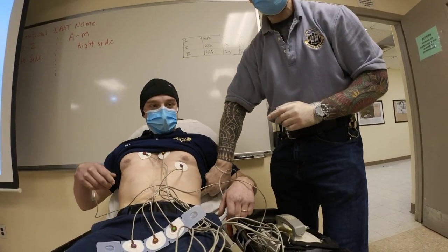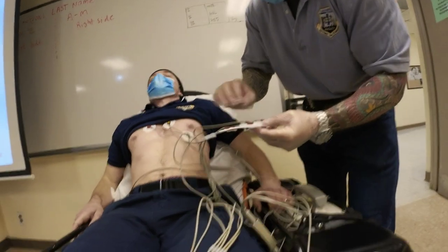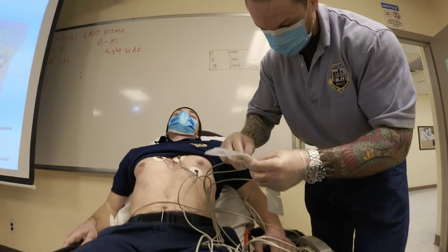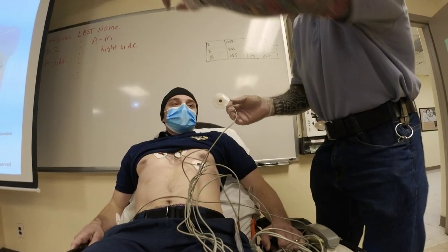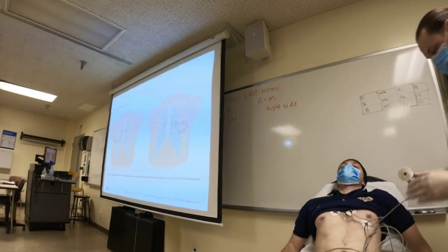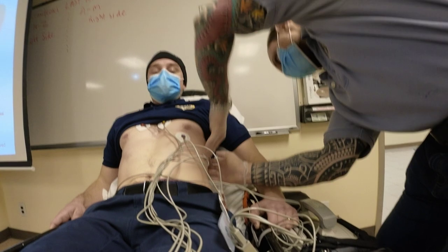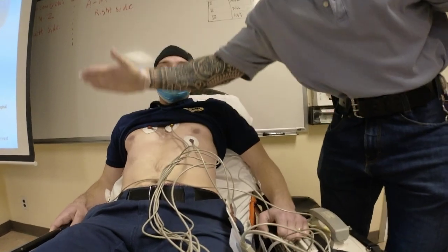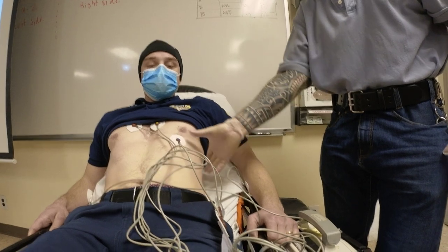What's the next lead I put? V6. Where does it go? Mid-axillary, fifth intercostal space. You notice how these pictures make you draw a curve? I don't want a curve, I want straight lines. So if I draw a straight line, straight line, straight line, that's what I want. Fifth intercostal space, straight line.